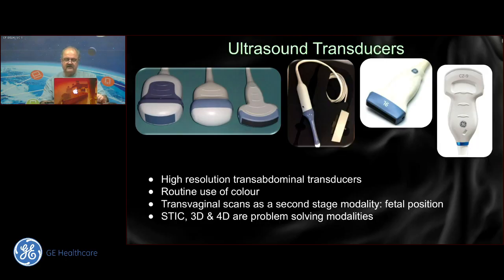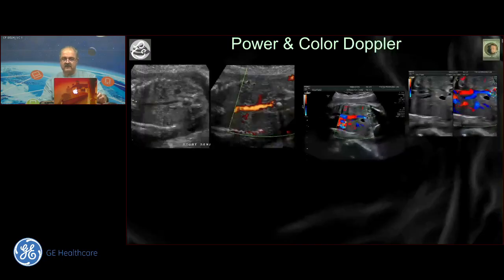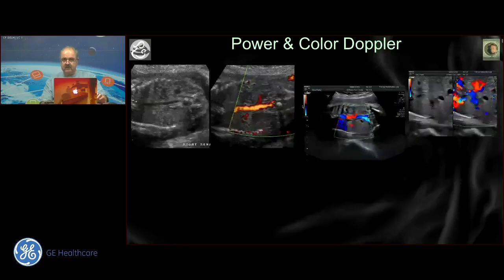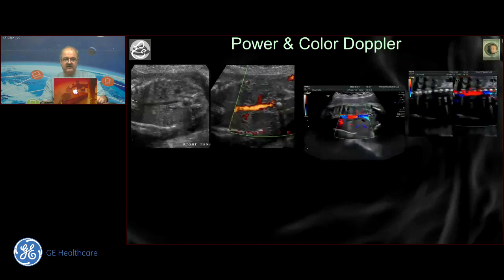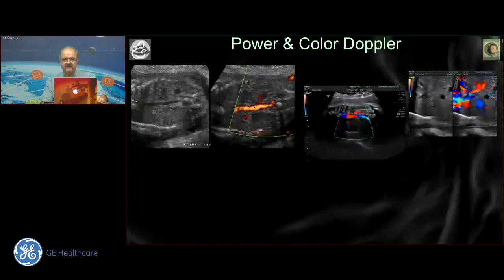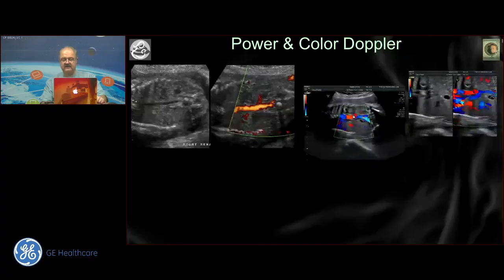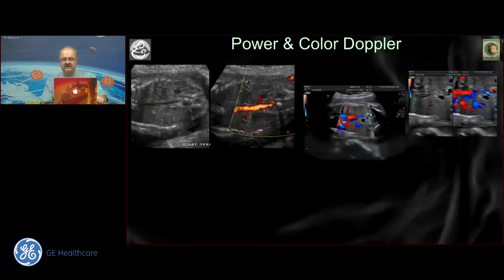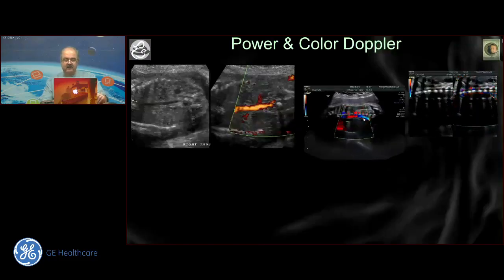It's also important to realize that primarily color and power Doppler can be used to demonstrate abnormal vessels, such as in a tumor, but also the absence of normal vessels. For instance, if you're strongly suspecting that there is no kidney on this side, then you switch on Doppler or power Doppler, and you realize there's only one kidney, one renal vessel here, the second one is missing. And here, of course, where we couldn't see any kidneys, and you can notice the paucity of liquor here, there was actually bilateral renal agenesis, also that there were no strange vessels arising from the iliac or the lower part of the aorta, indicating thereby that we're not even looking at a presence of kidneys anywhere, even in an ectopic location.